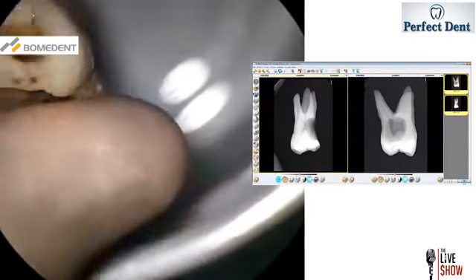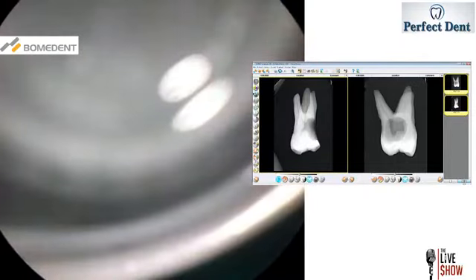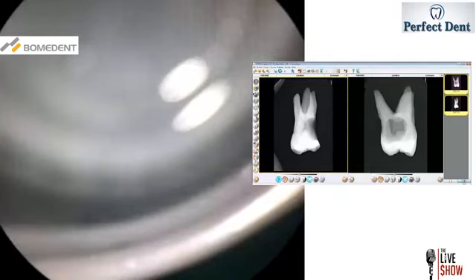I would start my instrument. Again, this is the Wisming instrument. Just adjusting the settings. Okay.